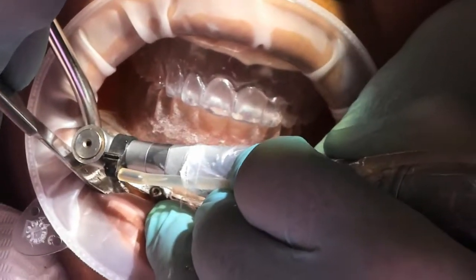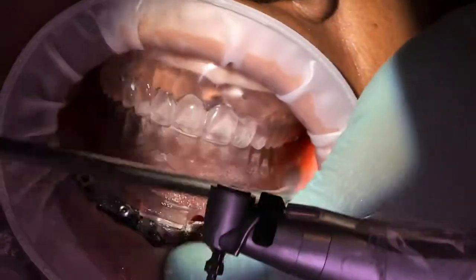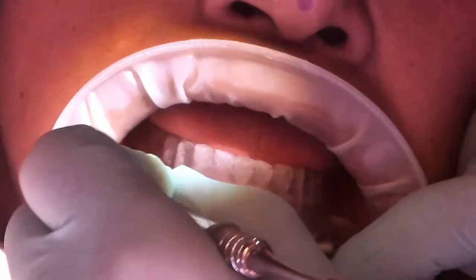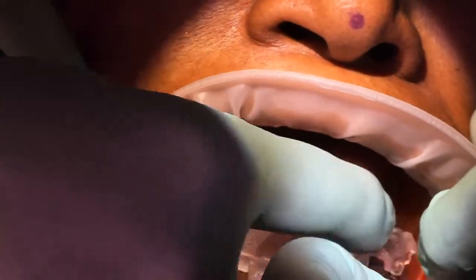In the maxilla, remove all the pins and the fixation base as well and prepare to lay the flap. You'll notice in this video that Dr. Towle, who's performing the surgery, lays a labial flap. This aids in simplified suturing later, as a bone reduction will allow the labial flap to be folded over the ridge.